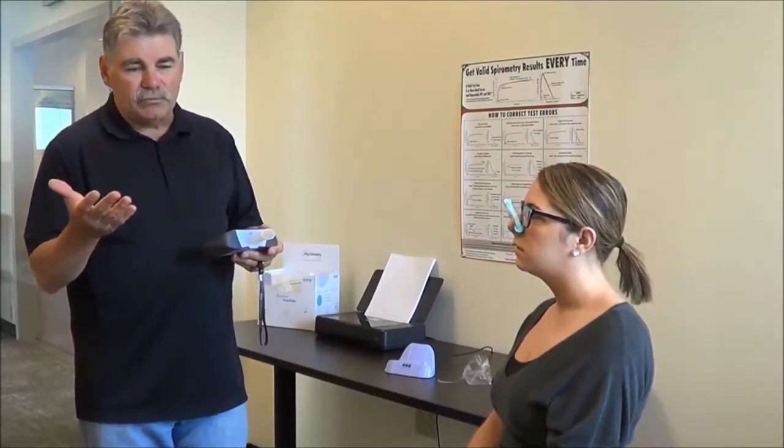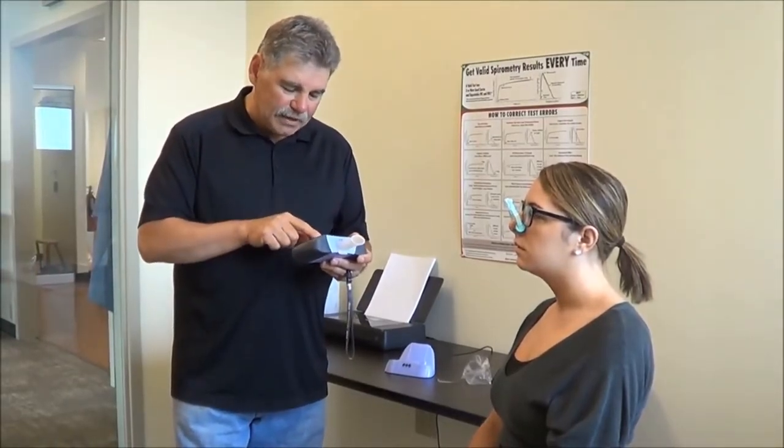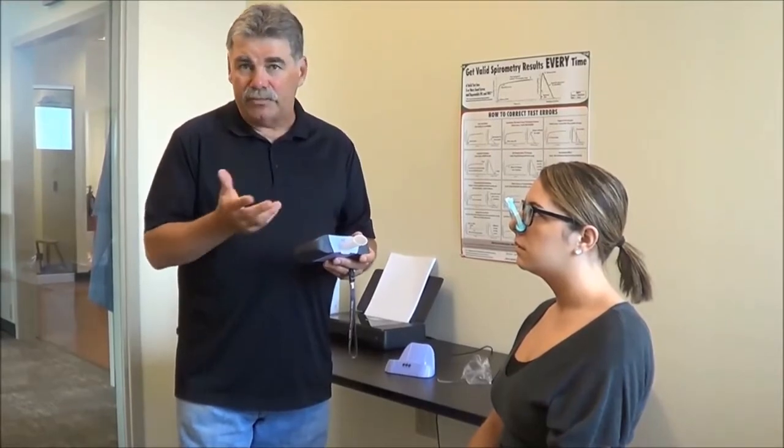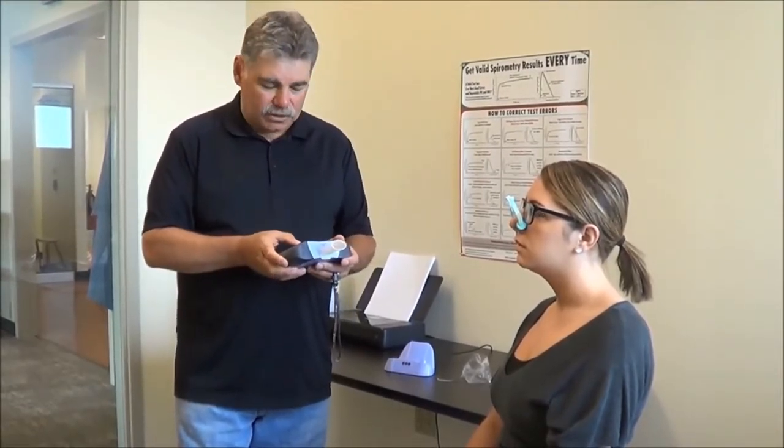As I mentioned, we need three acceptable trials. So far we have one. I have the options of add trial and data. Data meaning I can look at the more detailed data, or I'm ready for the second blow.